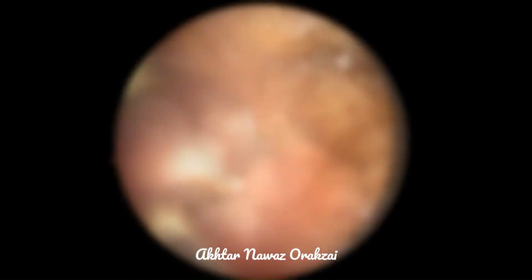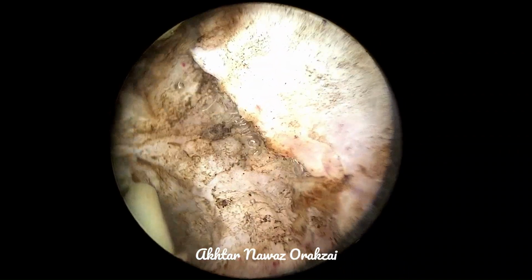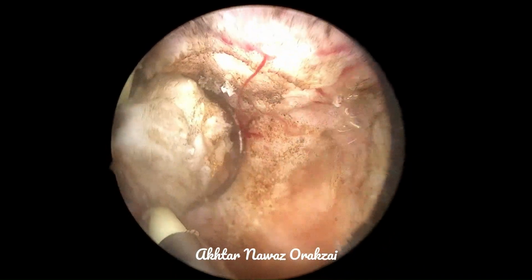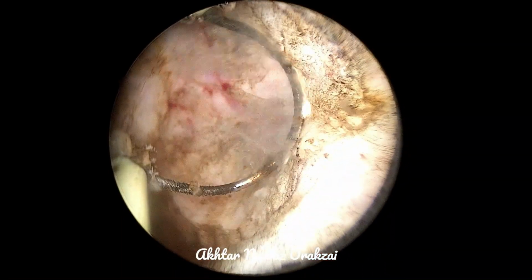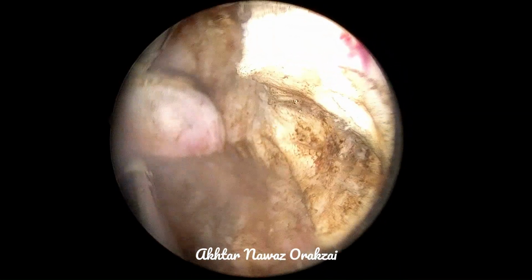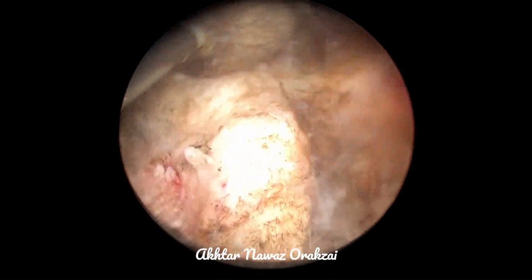So talking of the small black dots, they say that these are calcified. Microcalcifications have occurred in the prostatic glands because of chronic inflammation between the adenoma of the prostate and the true capsule. So they are a sign that the true capsule may be near. After seeing those black dots, you can see them around here. There are small black dots, you can see.